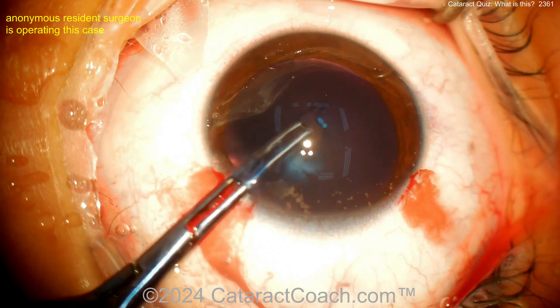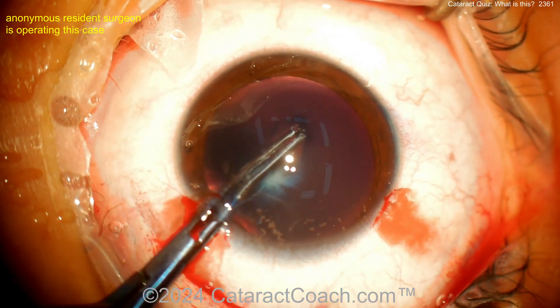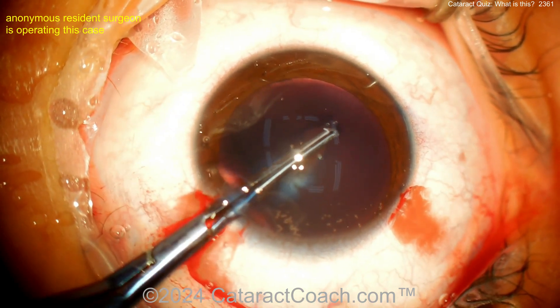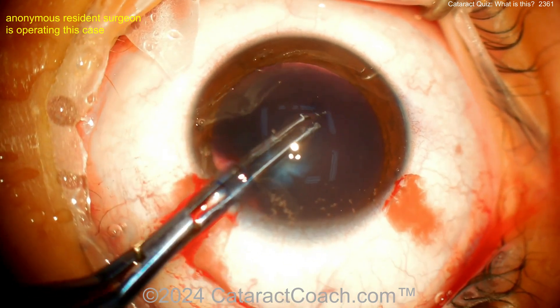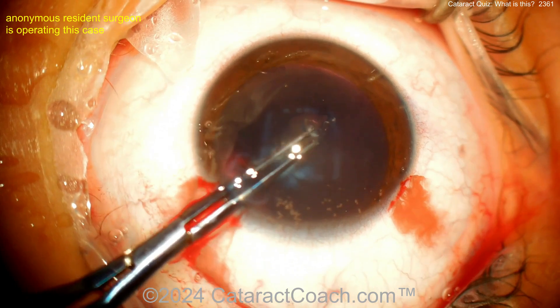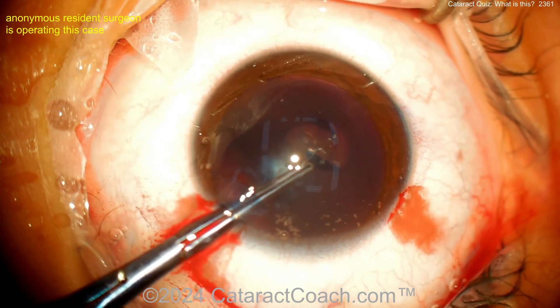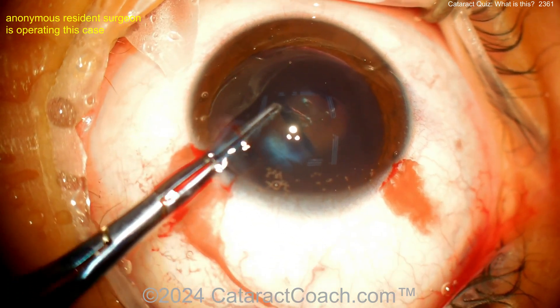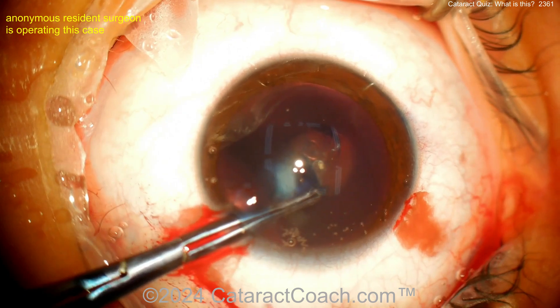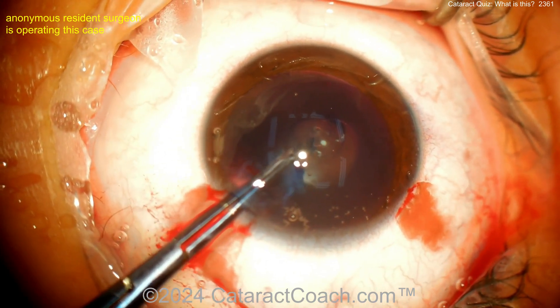Back to the case — capsule forceps here, getting a capsulorrhexis done. This looks like a very young patient; the exact age is unknown. Trypan blue dye, as you know, in a young patient is particularly helpful because it makes the capsule less elastic. In a pediatric patient, the anterior lens capsule is very elastic compared to an older patient — your typical 60, 70, 80-year-old cataract patient has a relatively inelastic capsule.